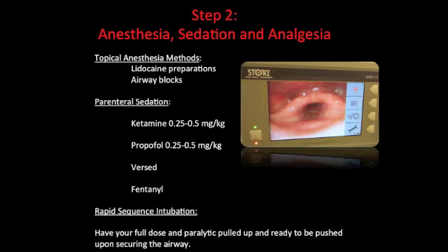Next, you really want to make sure that you have your RSI drugs pulled up, including your paralytic, ready to push as soon as you access the airway.